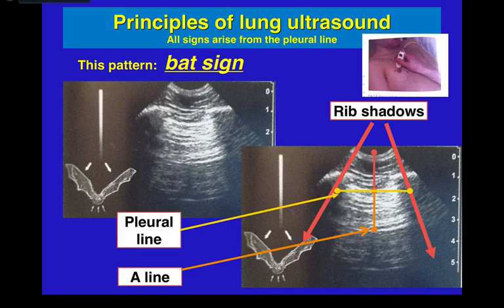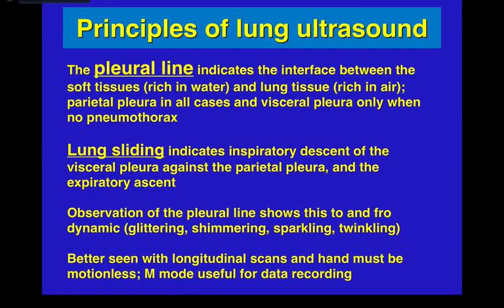A lines are horizontal lines that project below the pleural line. The pleural line is the first bright white line about 0.5 to 1 centimeter below the rib shadows. The pleural line indicates the interface between the soft tissues and the lung tissue — the parietal pleura in all cases, and the visceral pleura only when there is no pneumothorax.